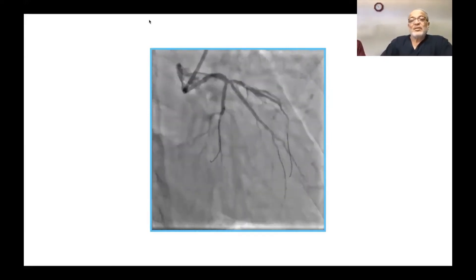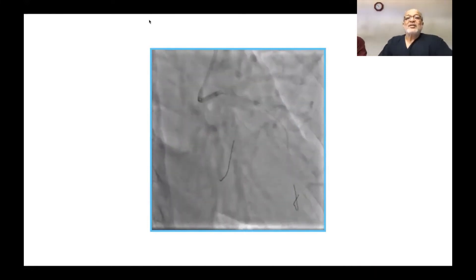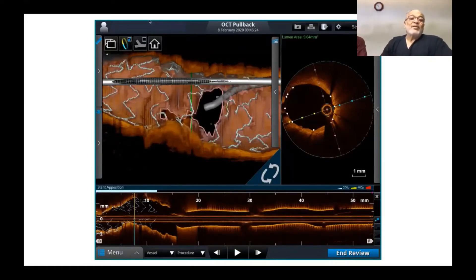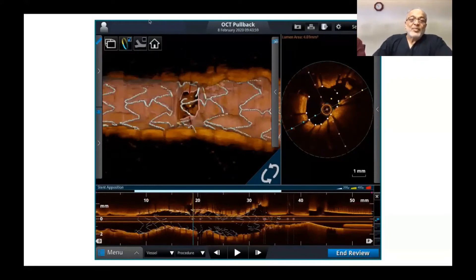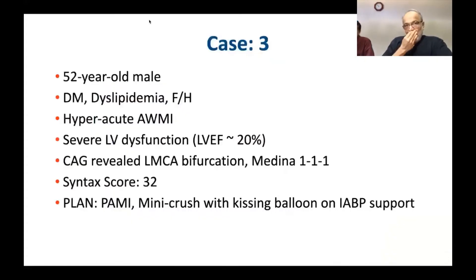We avoided stenting the diagonal, and similarly avoided stenting the circumflex artery. The left main showed distal crossing and link-free carina with a small ramus demonstrating a reasonably good lumen. The diagonal origin showed link-connecting carina, and after the intervention the diagonal origin picture looks reasonably good.